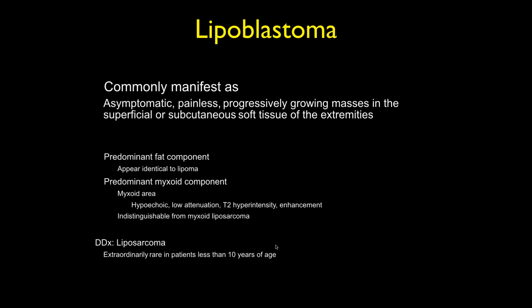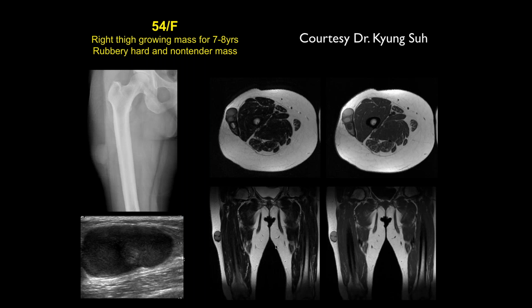What would be a more specific finding for this one? Well, you could certainly think of a dermoid cyst as well, like that last one. It's in some ways similar in characteristics, but it certainly looks sharply circumscribed. It doesn't look very aggressive. It does have lipid tissue in it, so it really looks like a benign lipid-containing structure, but it doesn't have the characteristic appearance that we saw of lipomas before. So this would be one of the more atypical ones. In this particular case, histologically, they call this a xanthoma.